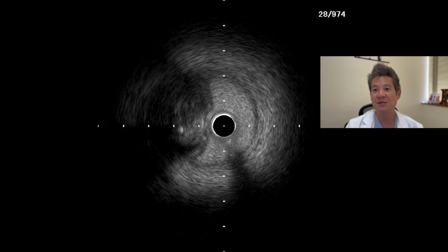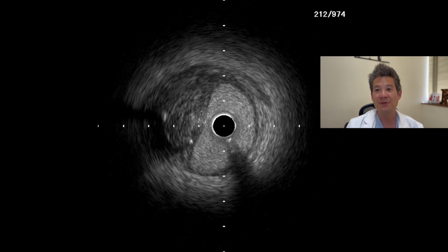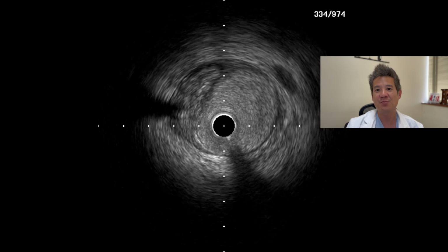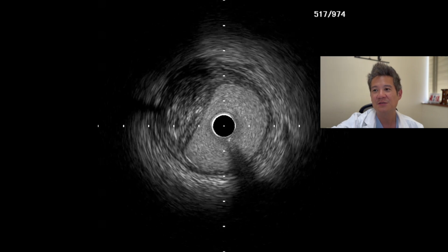This is 3D tip direction wire. You can see the tip, the wire disappears. When the wire disappears, it's pointing downwards. So the true lumen is at 3 o'clock to the wire, and the wire is pointing downwards. So we need to counterclock this 90 degrees to puncture forward. So we try to do 3D wiring, simultaneous and puncture.